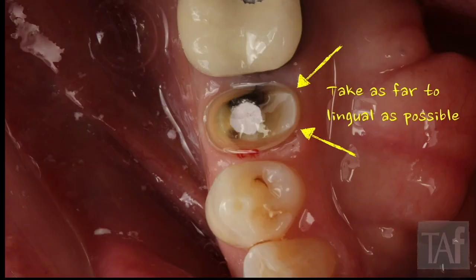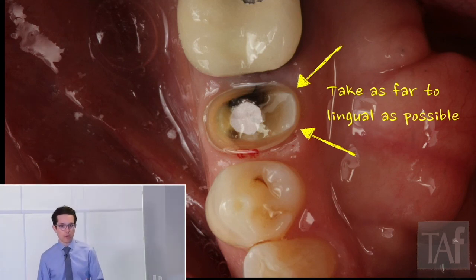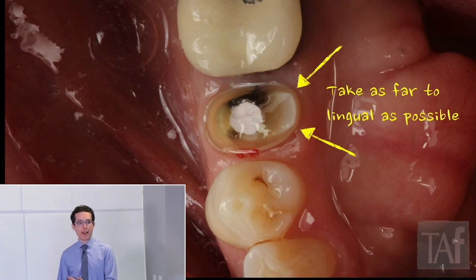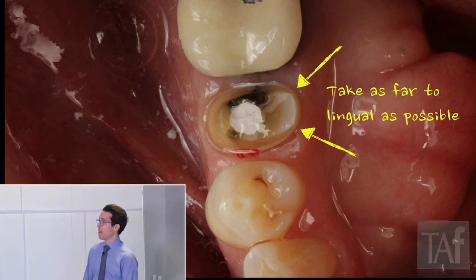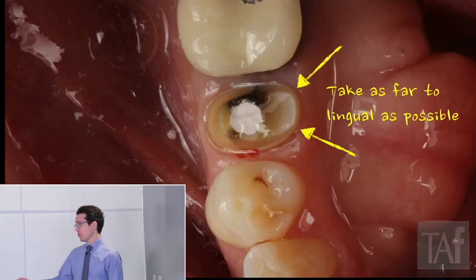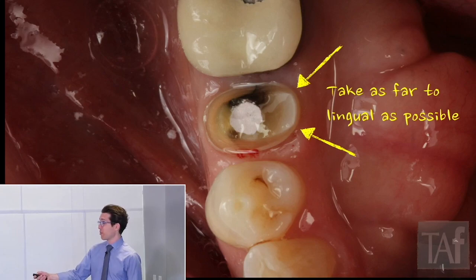A technique I've used over the years is to take that buccal and interproximal reduction as far to the lingual as I can see directly. I want to make my life as easy as possible when I get to the lingual reduction, because unless I'm working on the upper where I can use my mirror, on the lower — I'm a righty — I don't see the lingual very well on my right side. I'll make the patient work for me, which you should all be doing too. If you need them to turn to the right, have them turn to the right — have them move their heads. Don't make your life the only difficult one in the operatory. So I take my reduction to the lingual as far as possible, and you can see here all I have left is maybe a third to two-thirds of the lingual.